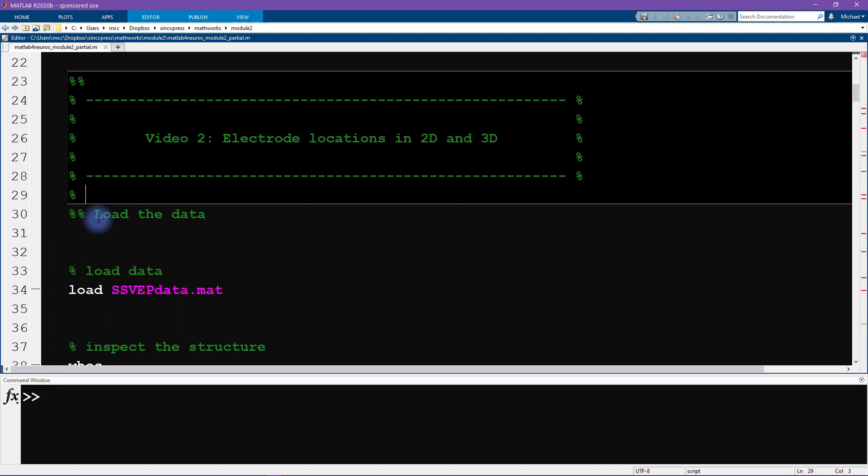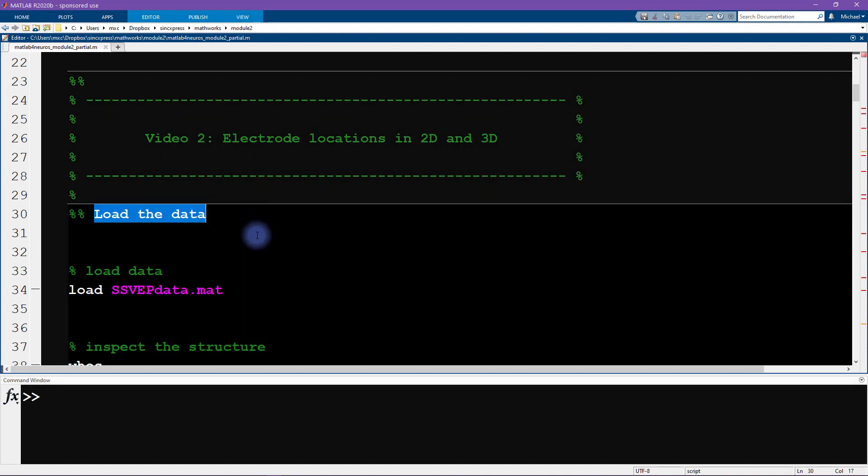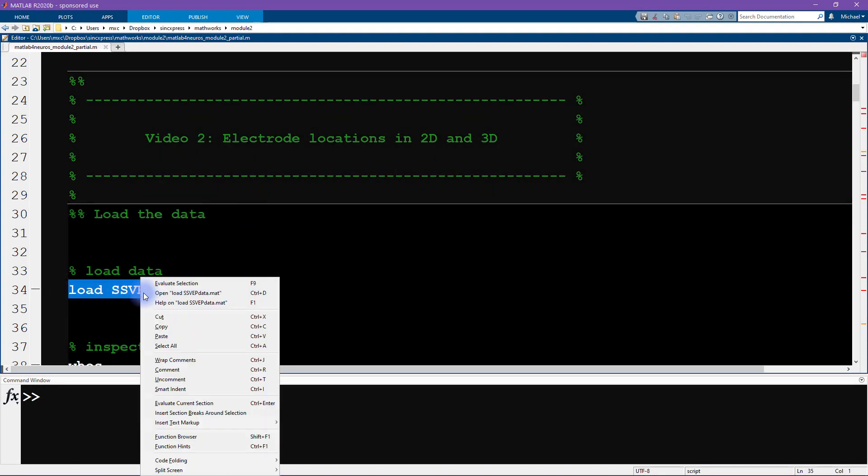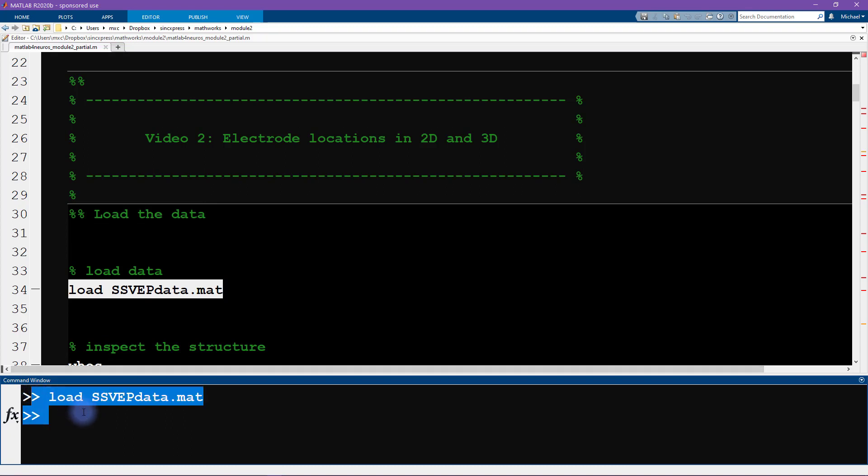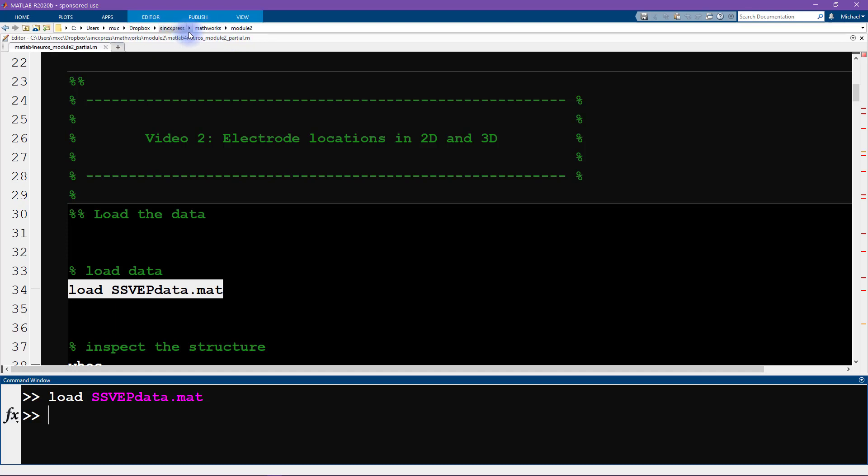We start by loading in the data. So I'm going to run this line of code. If this gives you an error message then it means that your current working directory is not where the data are located. You can change your current working directory or put the data file somewhere where MATLAB can see it, somewhere in MATLAB's path.